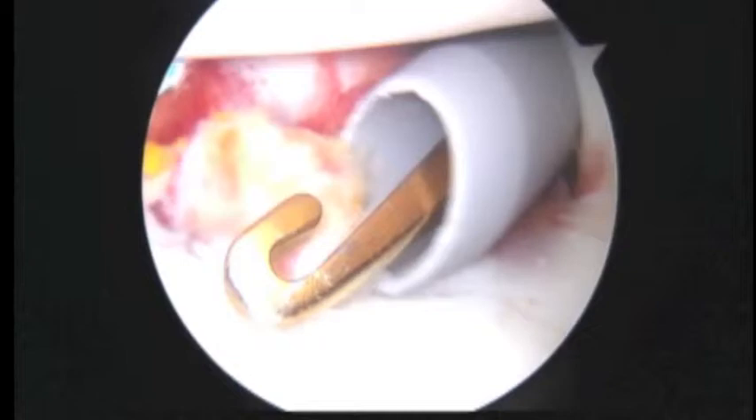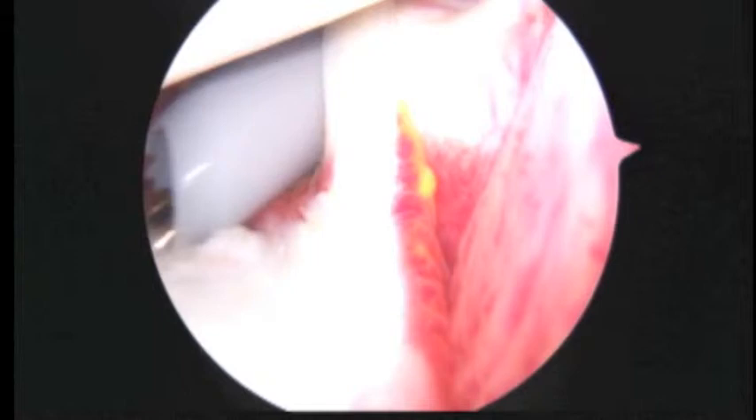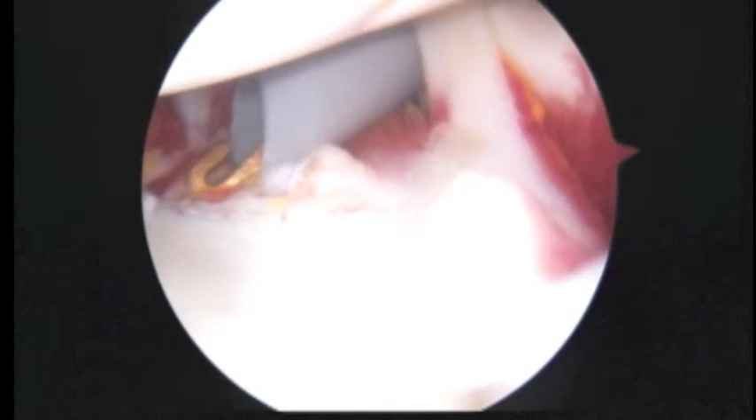There's the subscapularis there. I just want to make sure. I think we're going to finish up here. We're going to be very careful in the early rehab period just to give this all a chance to heal. But other than that, I've been real happy with what we've been able to do. There's a good look down the front. Good luck to you now.